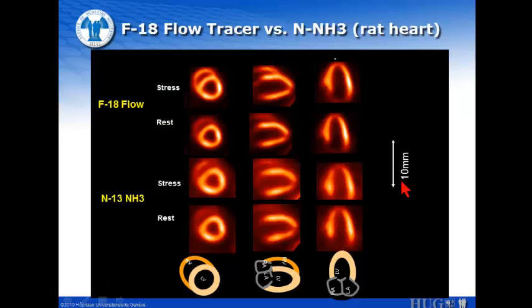So the other thing is, what do we have as new tracers in cardiac perfusion imaging? Because up to now, what is available is, for those who are lucky and have a cyclotron on-site, ammonia, which is quite nice. Then there's the generator-based solution using rubidium-82.